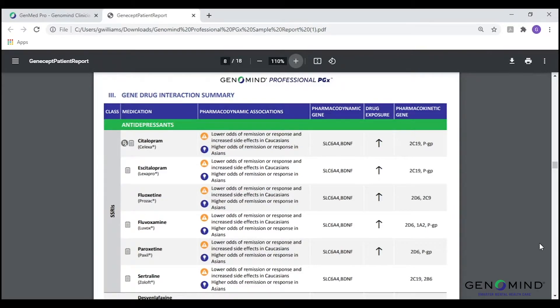Following the gene variations pages, the next section of the professional PGX report is the gene-drug interaction summary. These pages serve as a more concise overview of the patient's pharmacodynamic and pharmacokinetic variants as they relate to specific medications or medication classes. These pages display approximately 130 medications approved for psychiatric or neurologic indications and organizes drugs based on therapeutic class.